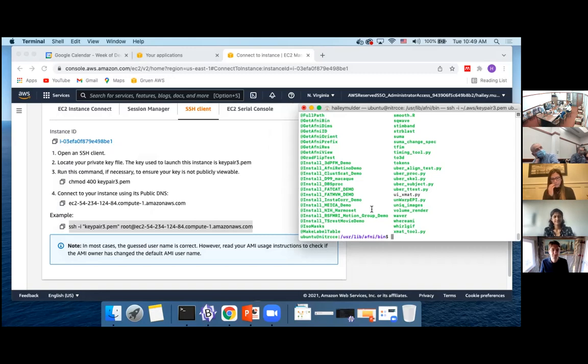So functional MRI analysis is when you're looking at how the brain is functioning over time. So when you look at activation patterns, that is a functional analysis, as opposed to structural analysis, which is saying the hippocampus is so much bigger in these participants versus this other group of participants.